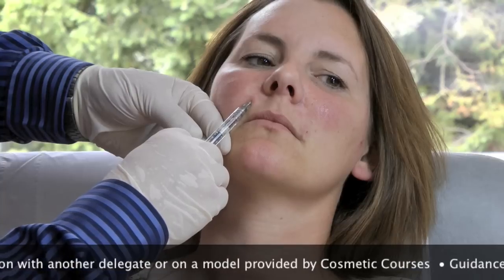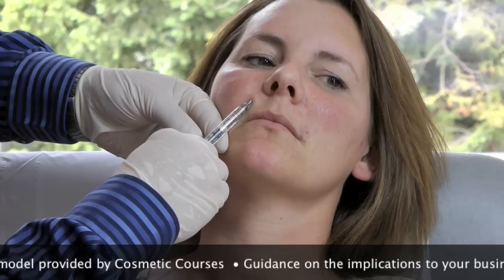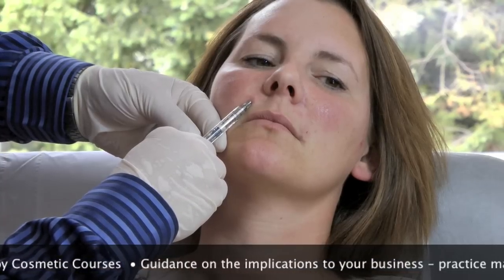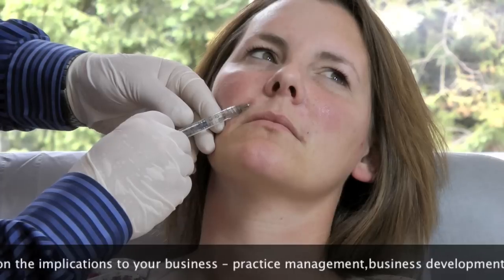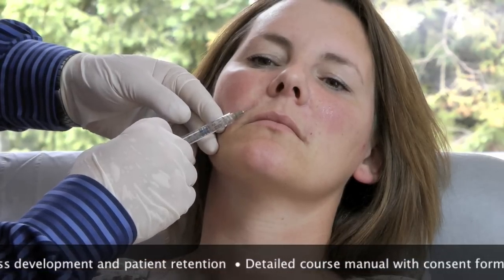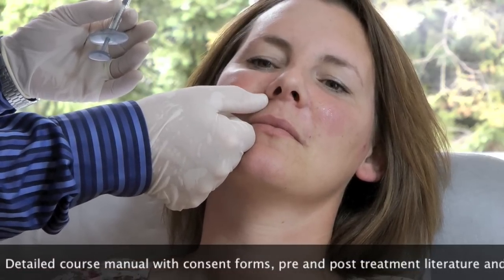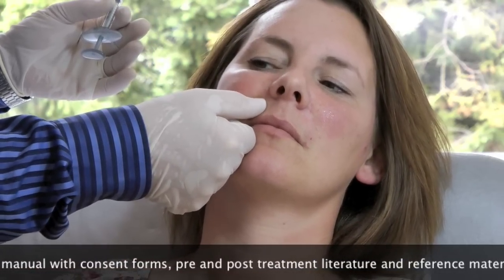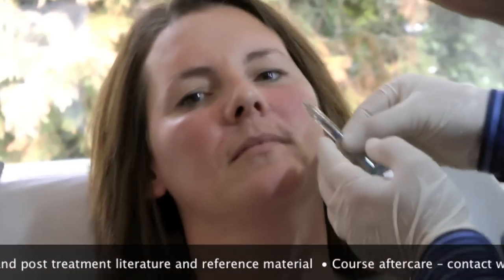I think it's me but it feels like it's easier this time — I think it's because I've got used to the pressure. Yeah, it takes much more pressure than you think. At the start of the syringe, even my hand gives a little shake getting it out, which isn't good on camera. So you're going slightly more into that now to fill the gap.